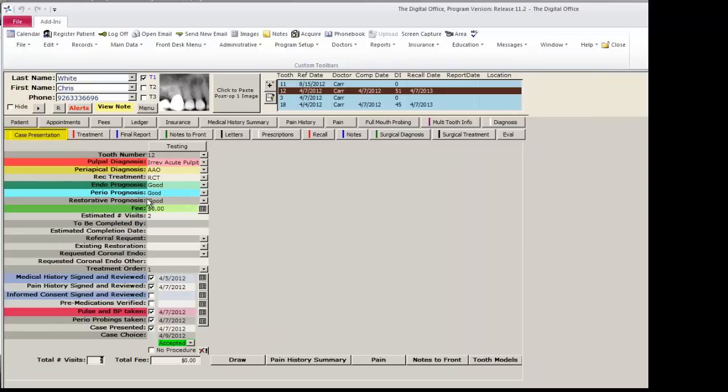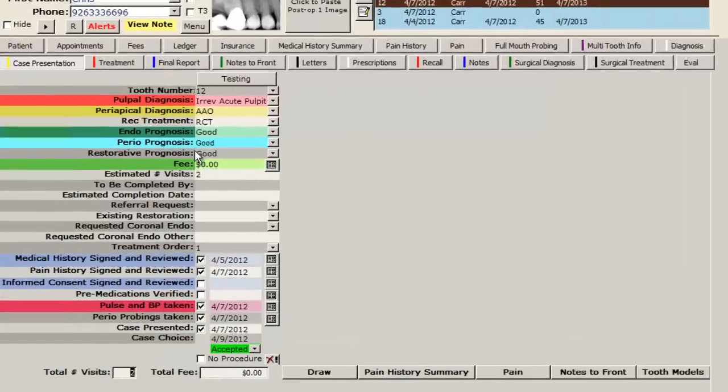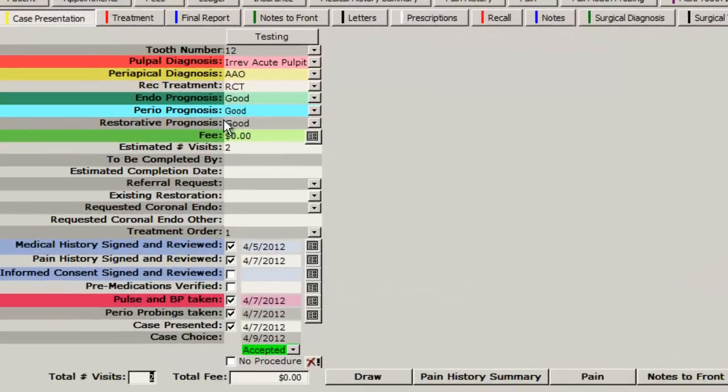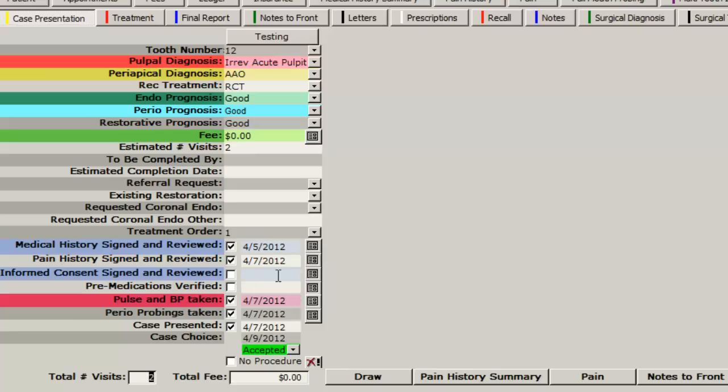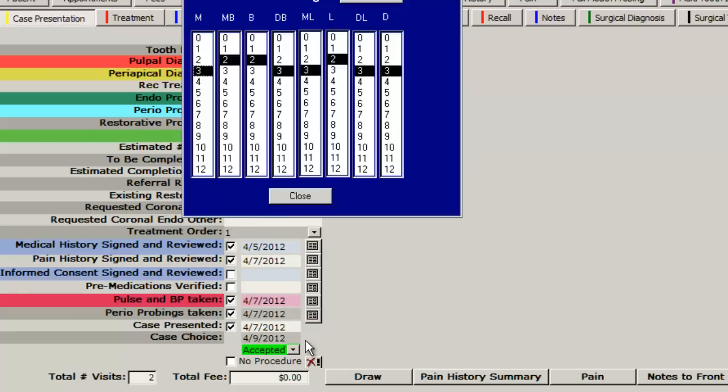This is a fabulous page to act as a safety checklist. This avoids anything that may have been overlooked and not completed. For example, if the informed consent had not been signed and reviewed, that can be completed at this time. If the pulse or perio probings have not been recorded, you can use the button here to enter that information.